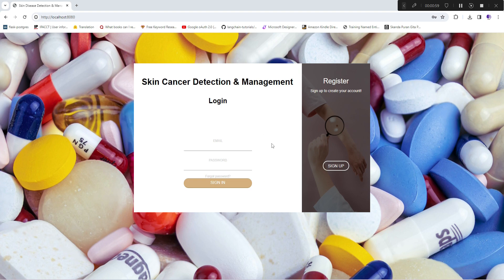I'll show how this skin cancer detection management system can work in a real-time scenario. Just a reminder: the model used for prediction has already been covered in a previous video on how to train a skin cancer deep learning model — you can check that out if you haven't already. In this video I'll quickly show what this app is about and its different features.